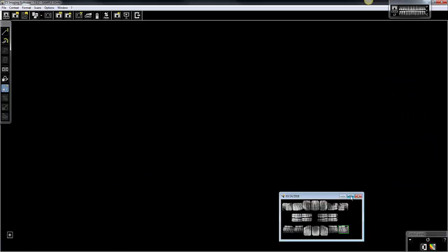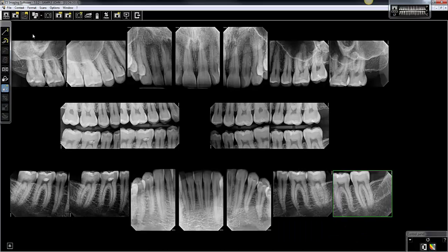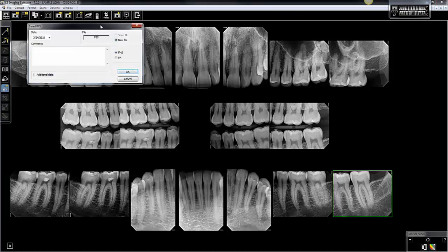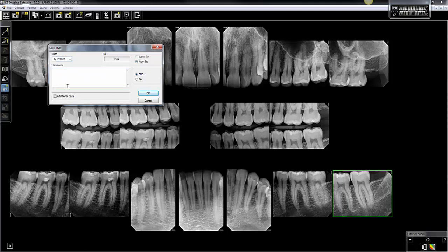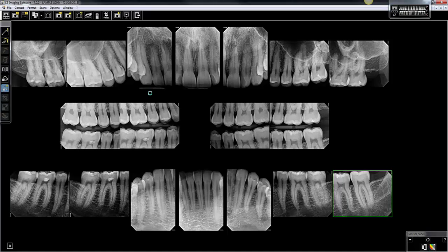There we go — we have them all inside of the mount now. The next step is to click the save icon. When this window opens, you have a chance to change the date from the current import date to whatever date the images were actually acquired on — say, January, a few months previous. You can select that date, and in this field you can add a clinical note, such as 'acquired at Dr. Smith's office.' Click OK, and now it's saved in the image history.